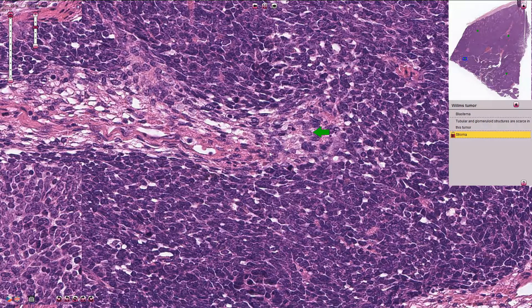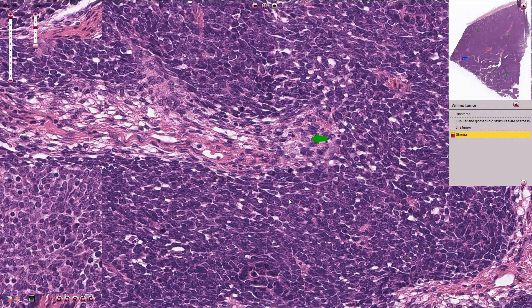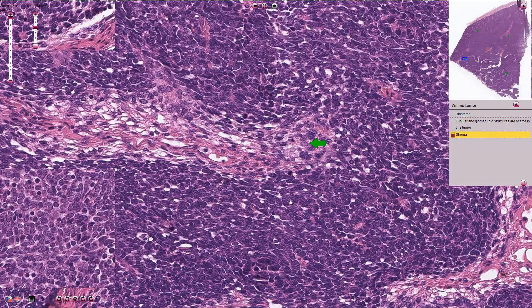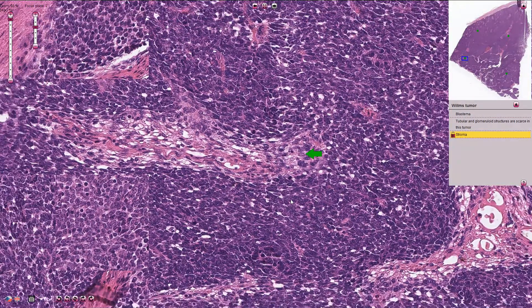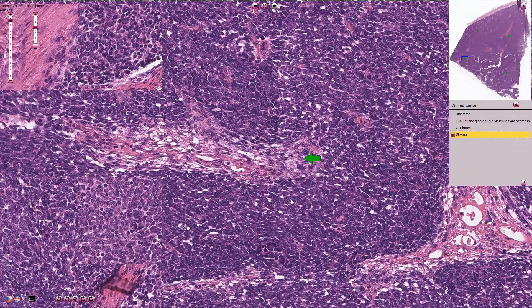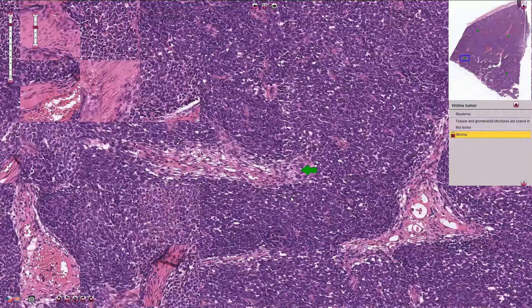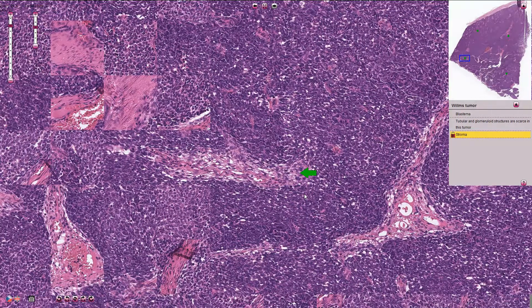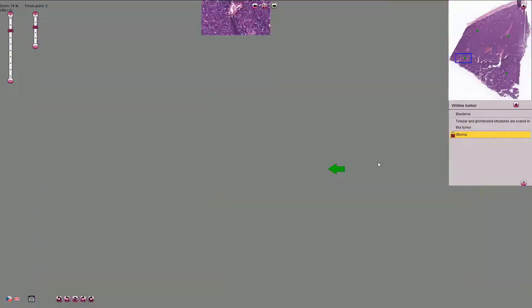So once again: mitotically active undifferentiated blastemal cells — primitive small round blue cells — are the first component. Epithelial tubular structures create the second component, and the stroma creates the third component. Together these make up the Wilms tumor or nephroblastoma.